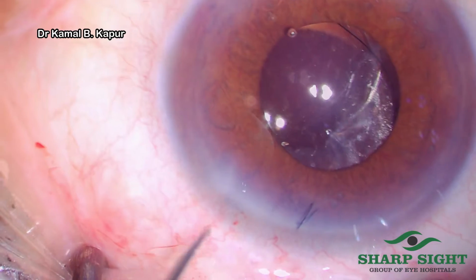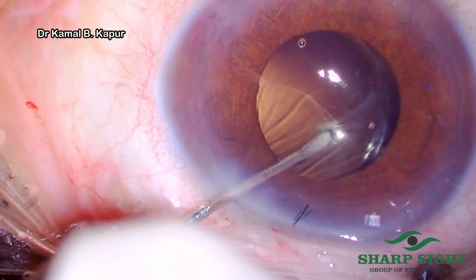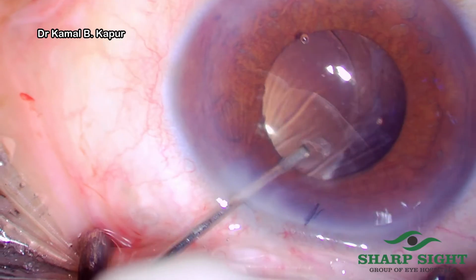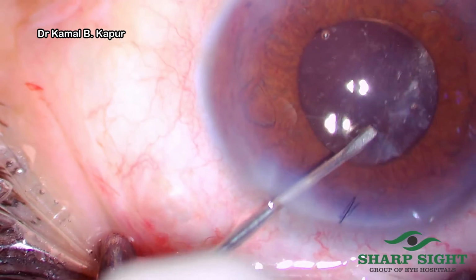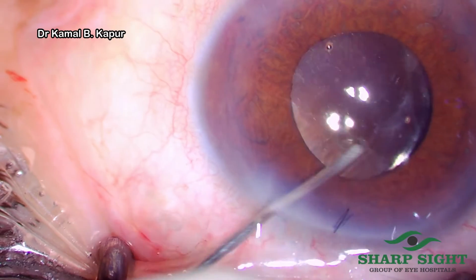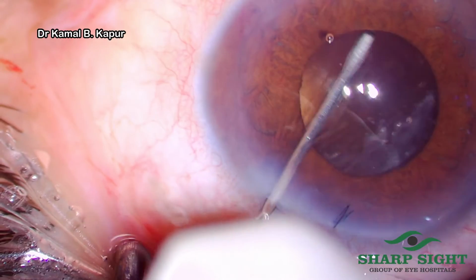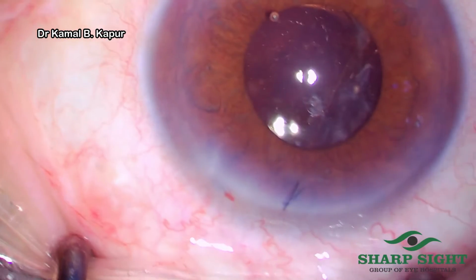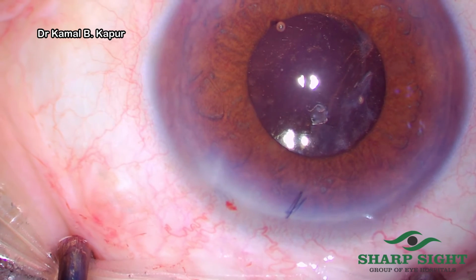IOL. We proceed to give a nick and relax this overhanging capsule so as to create a loosening effect on top of this IOL, and suddenly the moment we have cut the anterior capsule, we realize that the tendency of the IOL to decenter on its own has disappeared. You will notice that the IOL is now moving freely within the bag and the tendency to come back is gone.